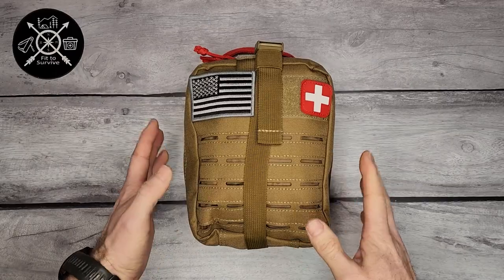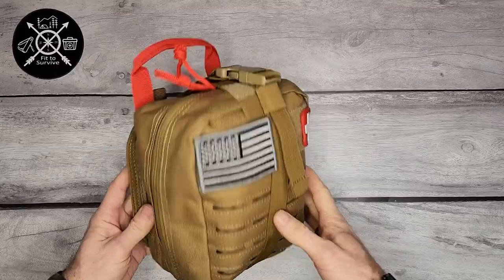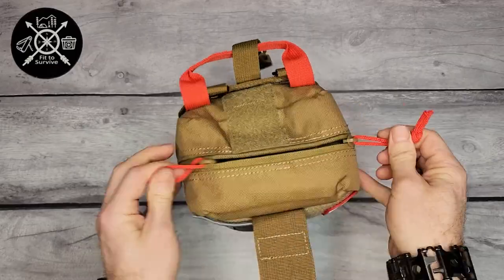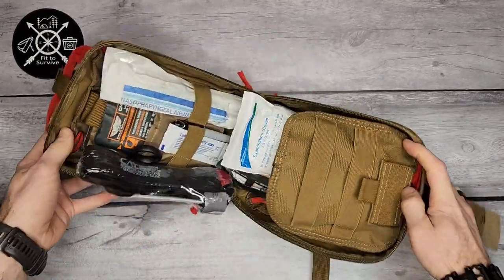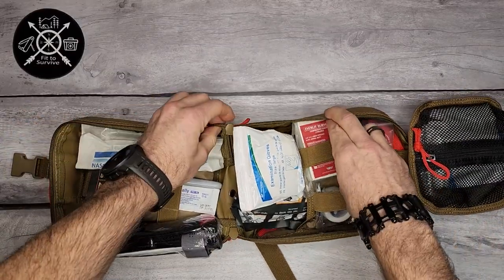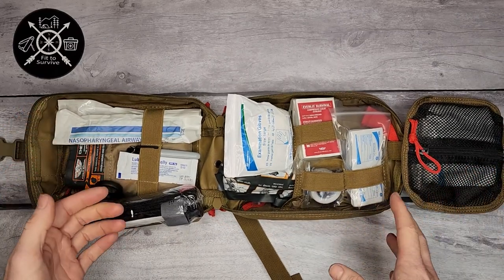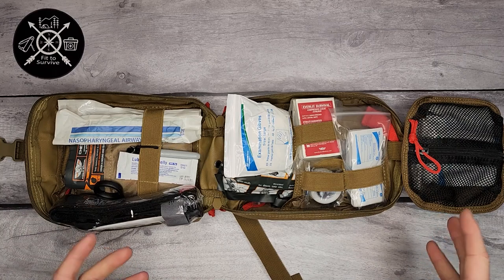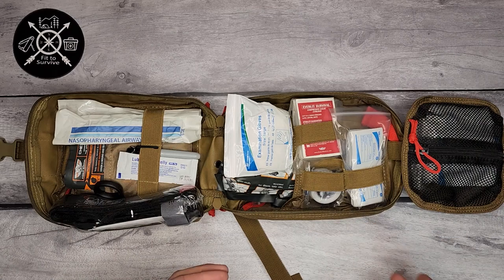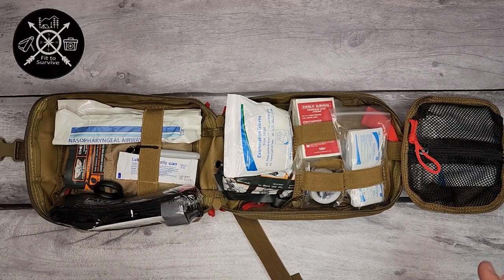Since they're all the exact same thing, I'm going to open up one of them and show you the contents. Keep in mind this is not a kit I put together — this is a ready-made kit from Everlit. I would recommend adding some more medical equipment to this, but it's a good foundation. If you're putting together your own trauma kit, this is great — it has all the basics and you can add whatever else you want, like allergy medicine or extra band-aids.